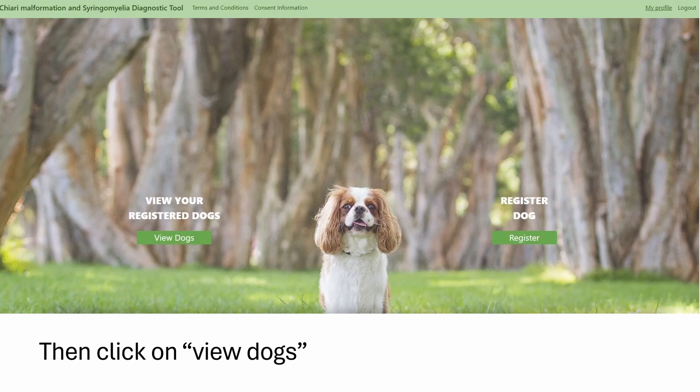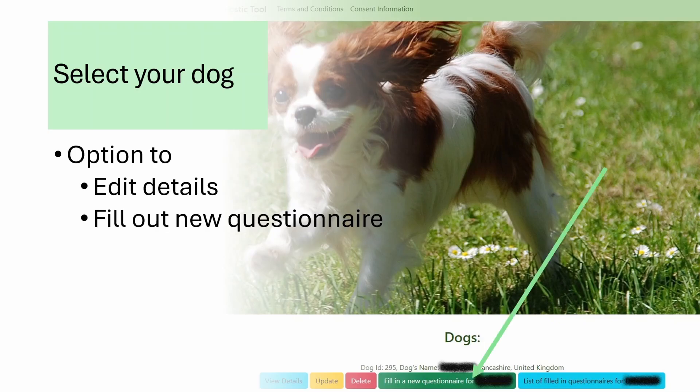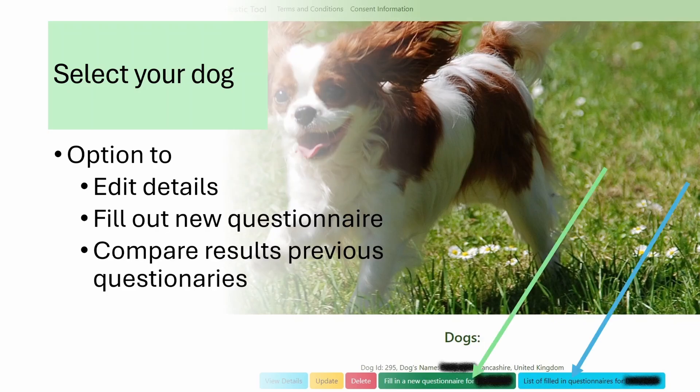Once you've registered the dog, you click on 'View Dogs' and find the dog in the list. The name shown here has been redacted, hence the blackout. You have an option to edit the details if, for example, you got something wrong like the birth date and had to guess it — that's quite common for a veterinary surgeon. You then have the option to fill out a new questionnaire or perhaps compare the results of previous questionnaires, for instance if a client has already filled one out prior to attending your clinic.